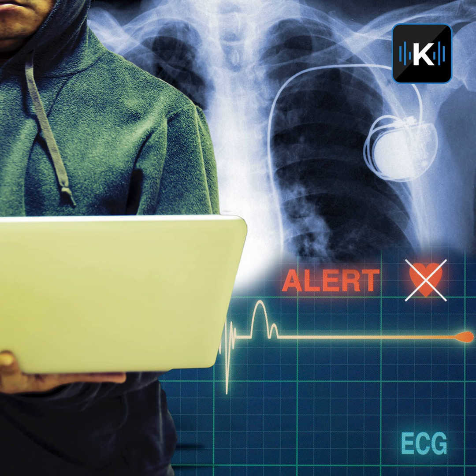A man by the name of Barnaby Jack, well, he knew exactly why. From 100 meters away, I can scan for any insulin pumps in the vicinity. I will return those insulin pump IDs, and then I can have them dispense their entire 300 units of insulin, which for a type 1 diabetic will easily prove fatal unless you seek immediate medical attention.